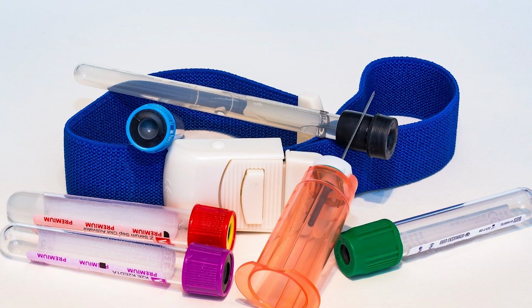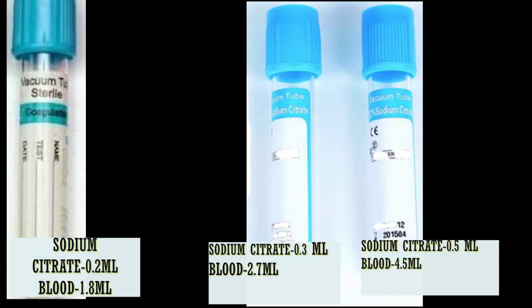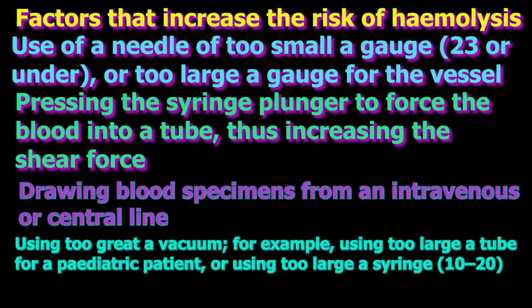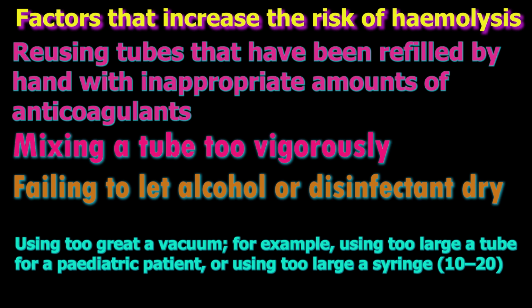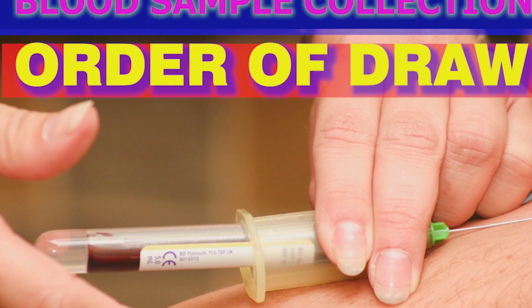Arrange the collection tubes. Arrange the required collection tubes before making the venipuncture. Do not search for the tube, as that makes delay in collection and clots may form. Use appropriate anticoagulated tubes. Blue top tubes are available for 2 ml, 3 ml and 5 ml. Do not use a 5 ml tube for pediatric or neonates, as it can increase the vacuum for small veins and cause hemolysis. Order of draw. Follow the order of draw to avoid contamination of sample between collection tubes. Please watch my video on order of draw on the same channel.